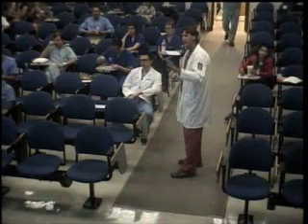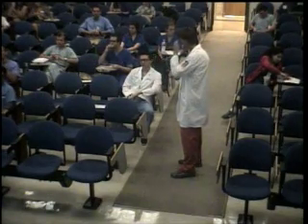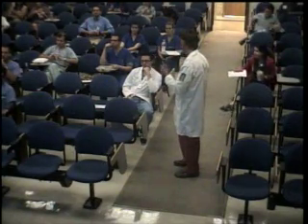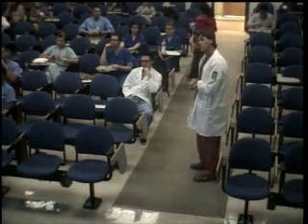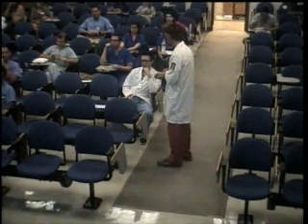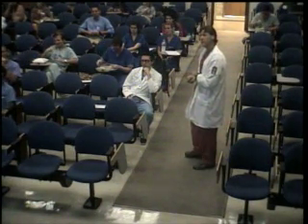Then you have type 2, which is more frequent, okay? On a normal background, you have multiple lucencies with different size and different shape. This case is maybe more permeative, that is the type 3. So these are the types 1, 2, and 3. In type 3, you have multiple lucent lesions, but ill-defined. Can you go there and tell me where the lesion ends? No, it's not possible. You cannot mark the X-ray and say, well, this tumor reaches this area.